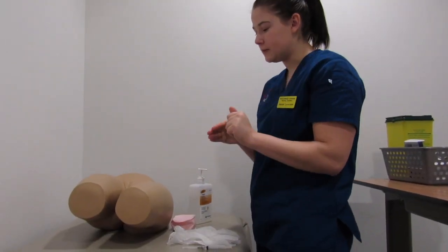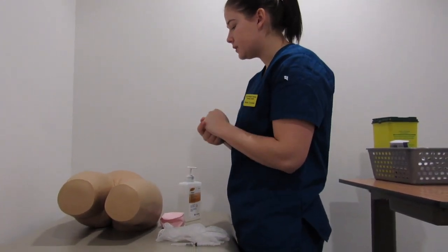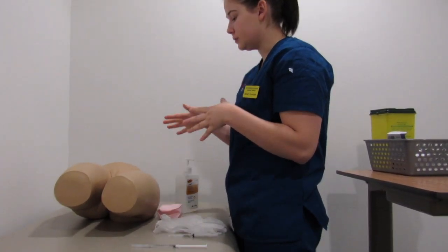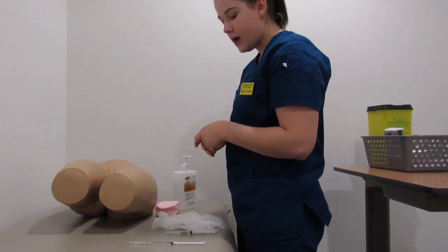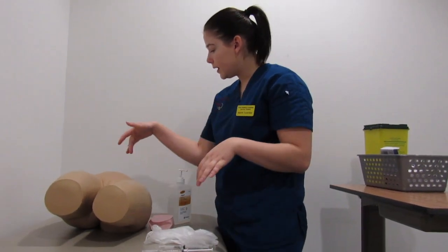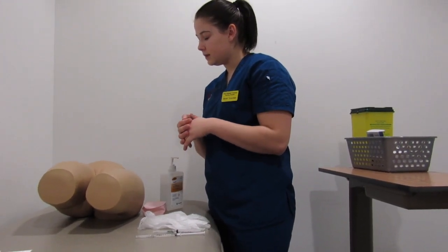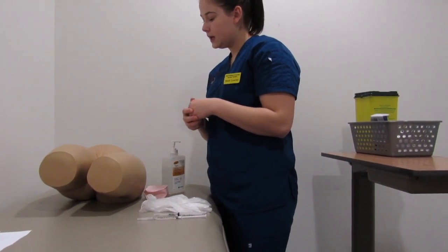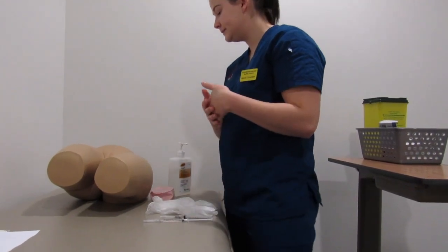So before I perform this subcutaneous injection, I'm just going to be checking the site and the patient for any circulatory shock and any issues with tissue perfusion. The patient looks fine and there's no issues that way. With a subcutaneous injection, it's going to be going either to the right or the left of the umbilicus, about 5 centimeters, and it's going to be going in at a 45 to 90 degree angle to get into the subcutaneous tissue just underneath the dermis.